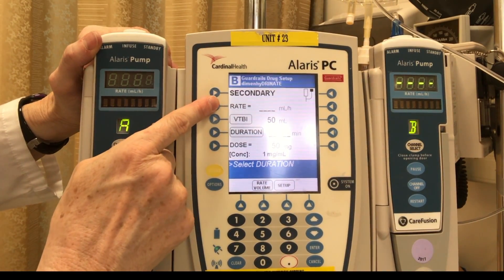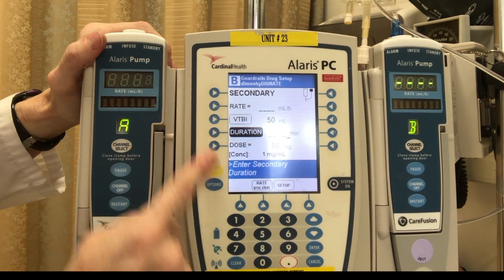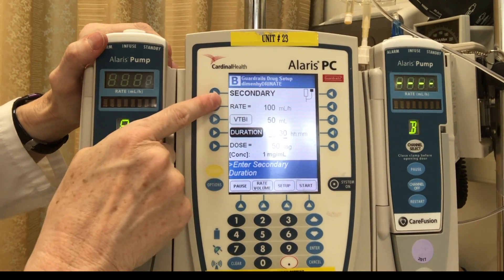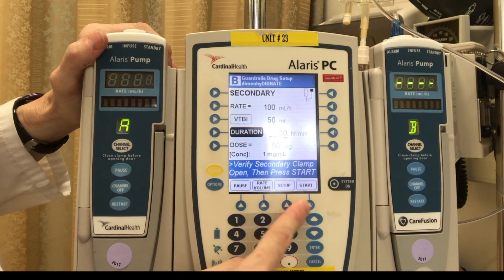I would like this to run over — you can either set your rate or your duration. So if I say I want it over 30 minutes, it programs the rate. And then I can hit start.